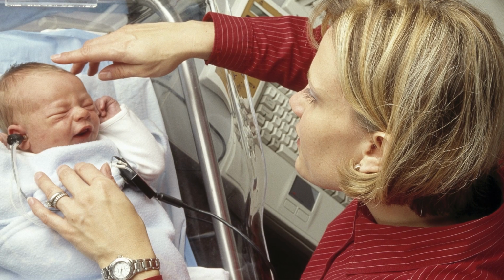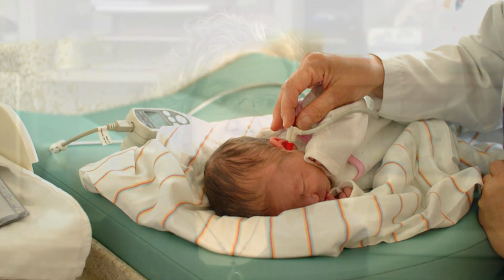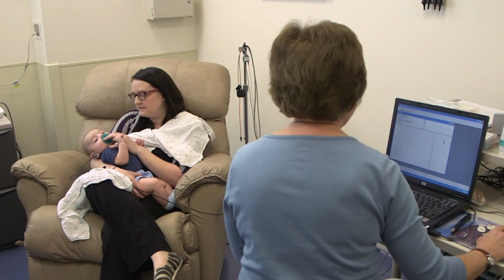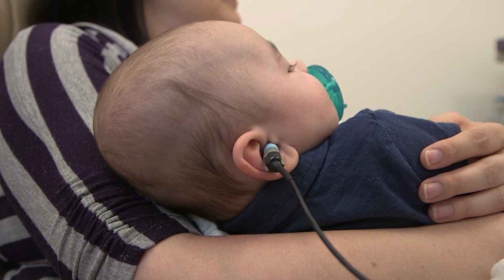All hospitals in the United States screen for hearing loss. These simple, relatively quick screening tests are done in the nursery, usually before the babies are discharged home. We have two methods to test newborn hearing. One is called otoacoustic emissions and the other is auditory brainstem response.